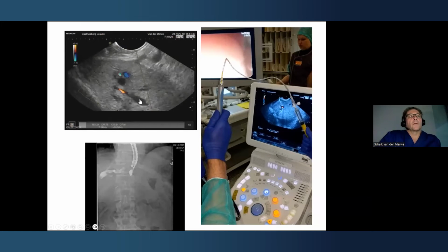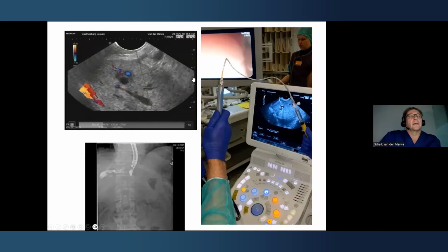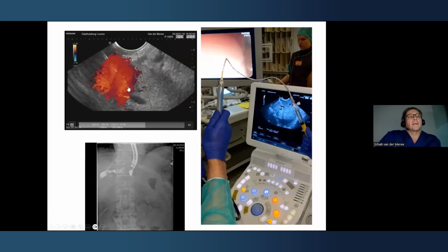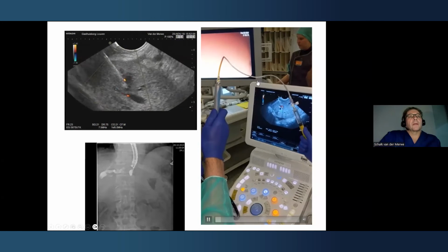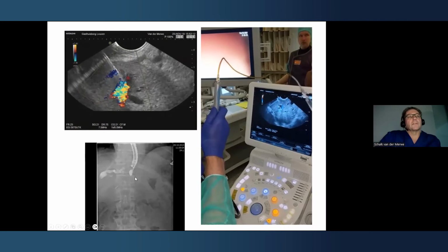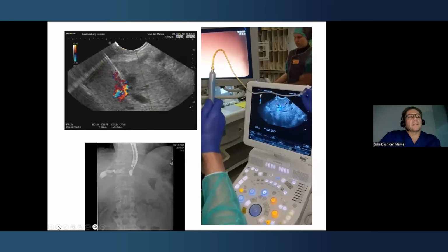So in this case, we identify a dilated duct from the proximal stomach, a dilated bile duct, segment 2 duct, and we can now use the EUS guided 19-gauge needle guided into the dilated duct. As soon as that is done, it may be advisable to aspirate, which may confirm that you're in the duct, and then contrast can be injected to identify the anatomy, and then to proceed advancing the guidewire for endoscopic therapy.